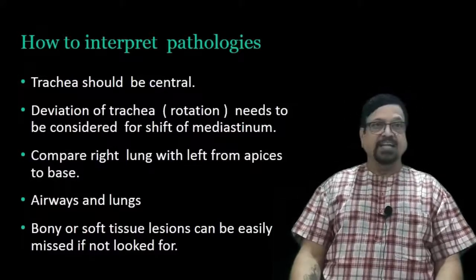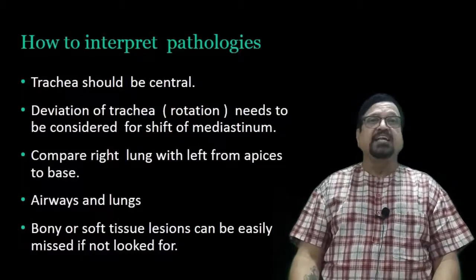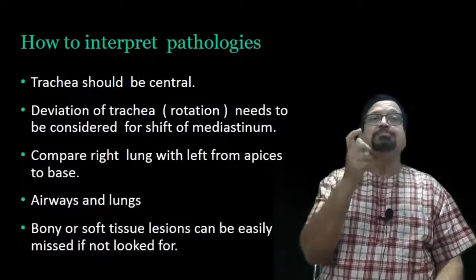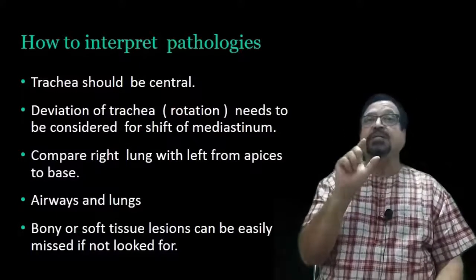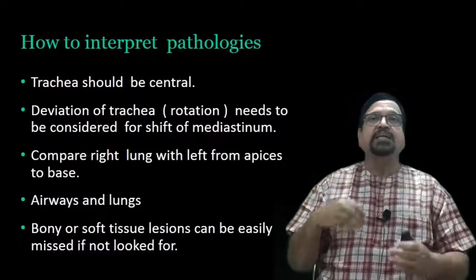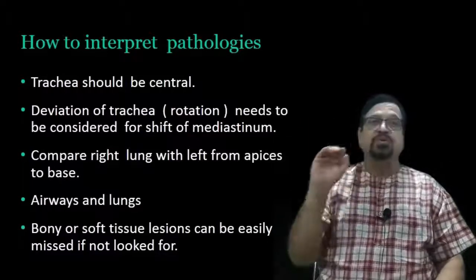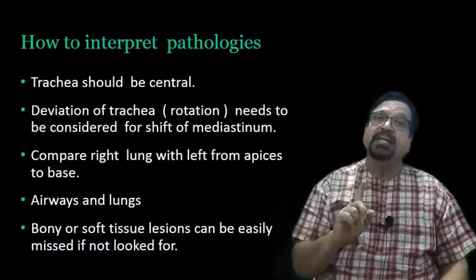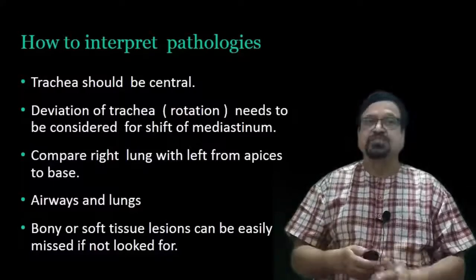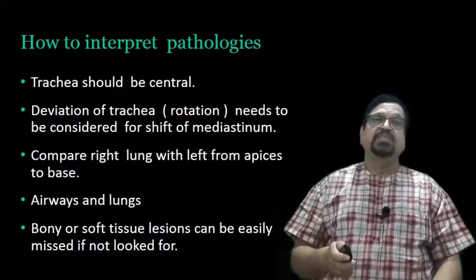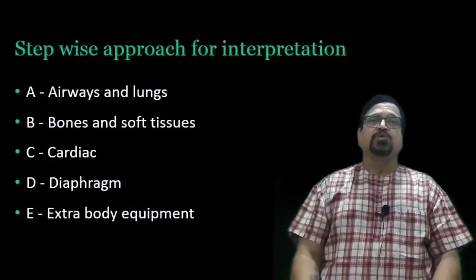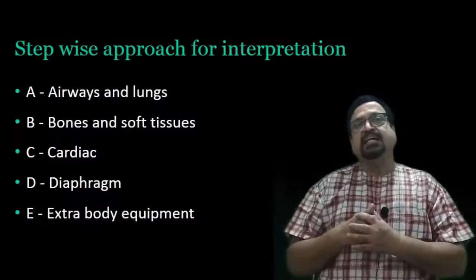A simple thing: the trachea should be central. Deviation of the trachea needs to be considered for shift of mediastinum. Now if the patient is rotated or the spine has abnormal curvature, you are going to get false interpretation of tracheal deviation. You have to compare right lung with the left lung - apex to apex, mid zone to mid zone, low zone to low zone. The airways and lungs should be properly inspected, not only for X-ray interpretation but subsequently for tubes and catheters. We have to look for bony and soft tissue lesions, otherwise they will be missed easily.